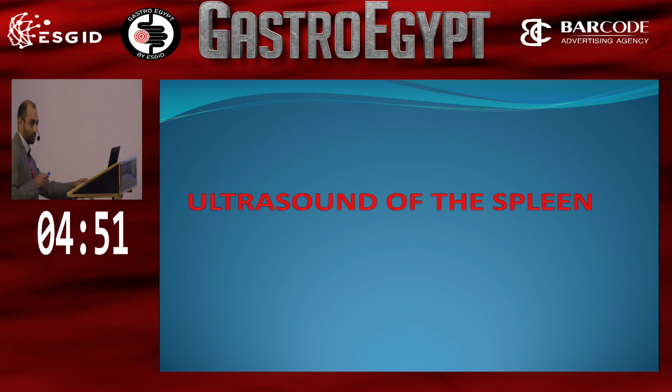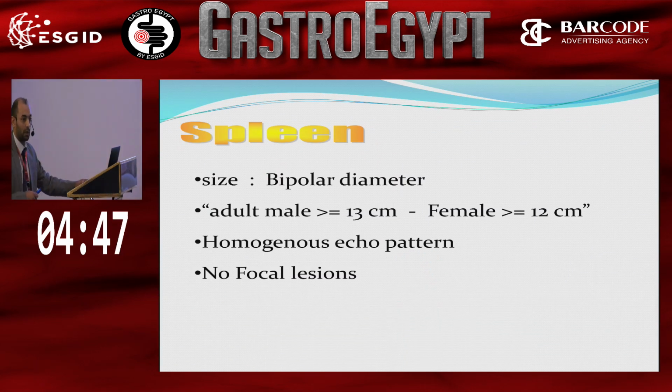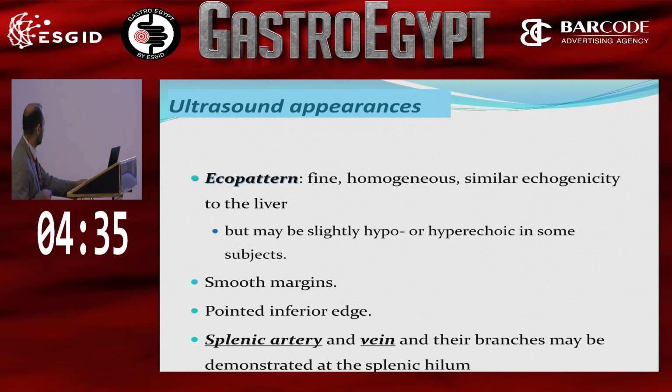Spleen, this belongs to you. The spleen is also covered by the colon, the splenic flexure. So I have to go back to examine the spleen. I have to comment on the size, homogeneity, and whether there is a focal lesion or not. Okay.